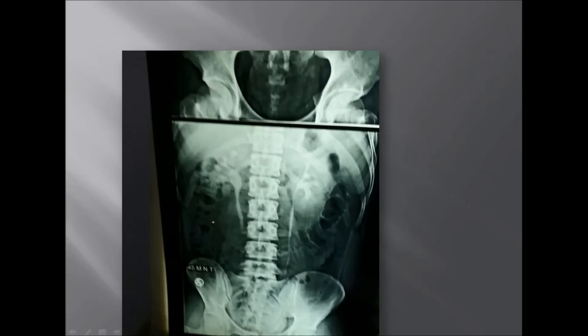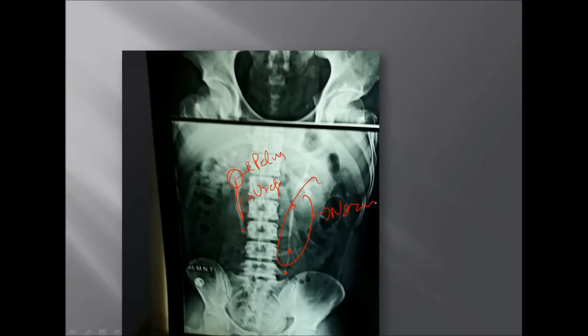At the 45-minute film, we can see that the obstruction is still present. The entire renal pelvis and upper part of the ureter are still obstructed on the right side. You can also see the natural ureteric constrictions, which are the normal sites where stone obstruction is more likely. On the right side we can see abnormal stasis due to stone, while the left side is completely normal.